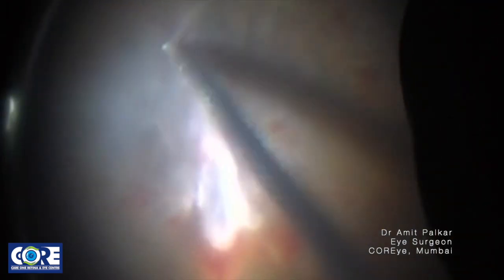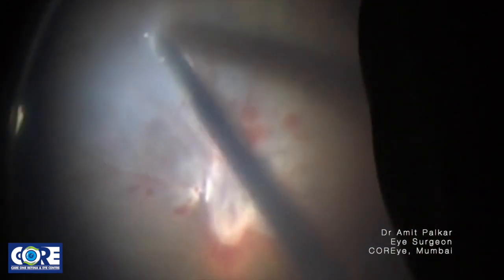Now here we see the hyaloid again adherent to the retina and getting separated. The purpose is to lift the posterior hyaloid, make linear breaks in it. How easily it helps separate the hyaloid.